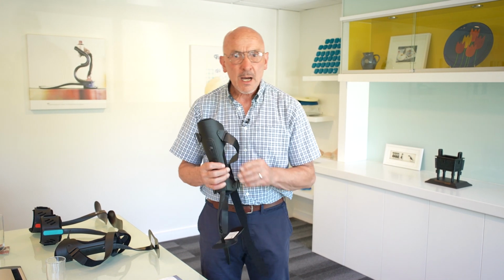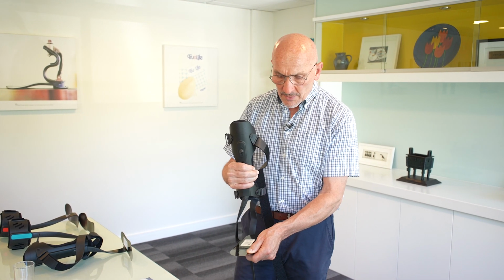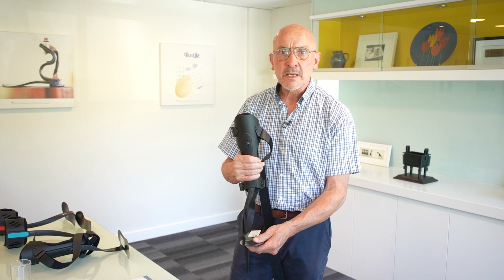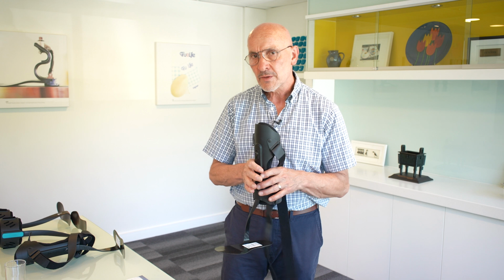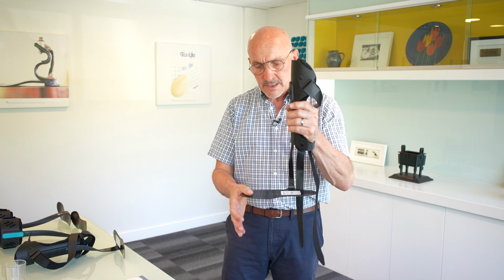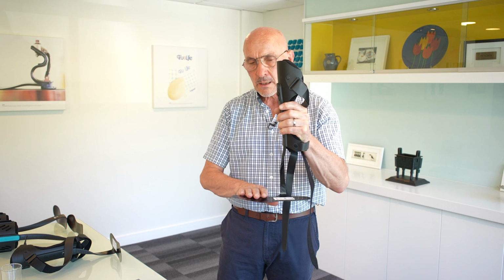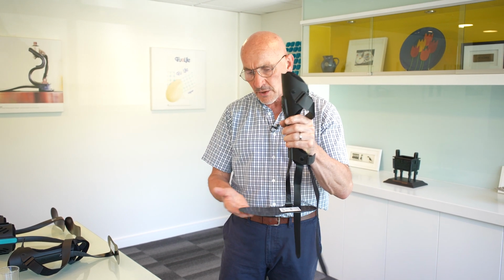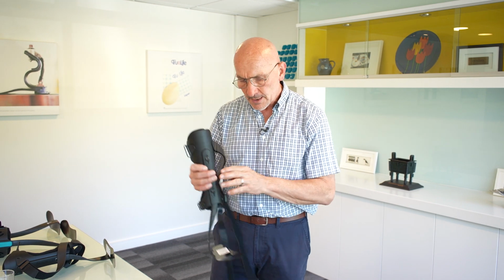The idea behind it is that where we have a drop foot issue with a patient from any or all of these different types of conditions, the brace loads up and gives a dorsiflexion assist through the swing phase of the gait cycle. And what happens is it loads up the carbon arm, and as we reach the gait cycle, it releases that energy to create, as you can see from the picture of the toe plate, a good dynamic dorsiflexion lift of the patient.